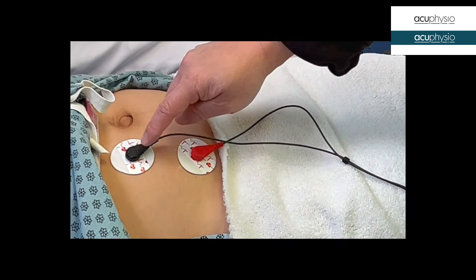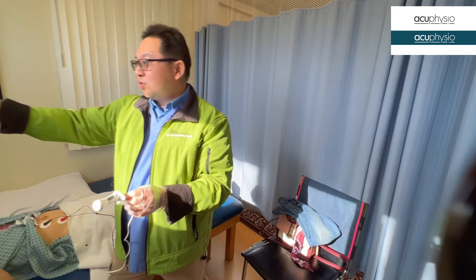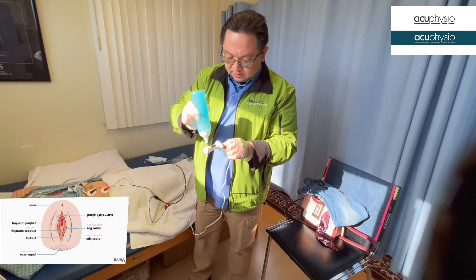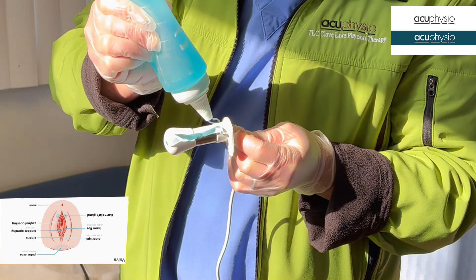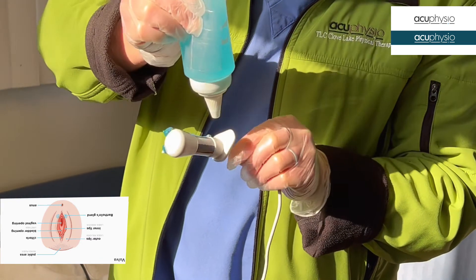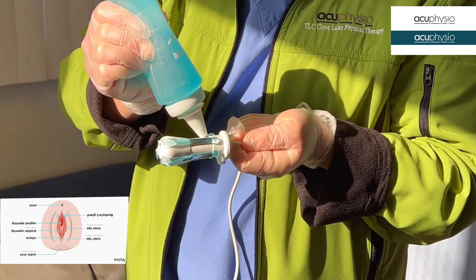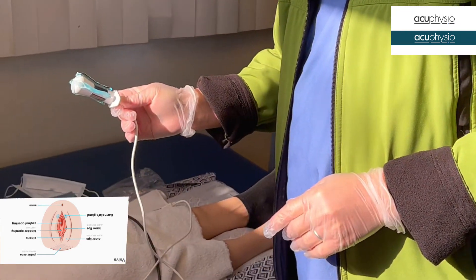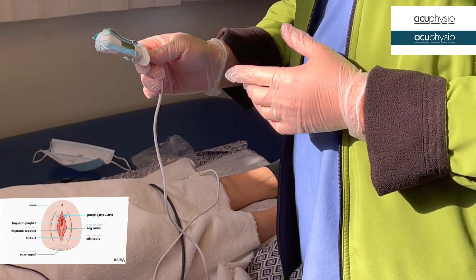And this is our sensor — this is the vaginal sensor. What we are going to do is put some gel into the sensor head to lubricate the entire sensor. And then we are going to put that into the vaginal area to detect the pelvic floor muscle contraction.